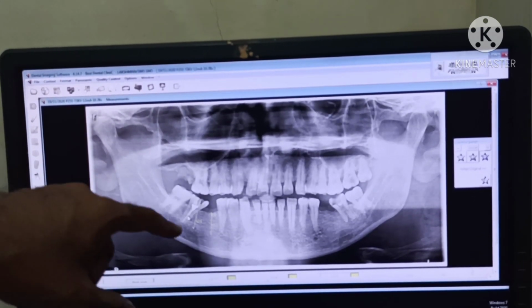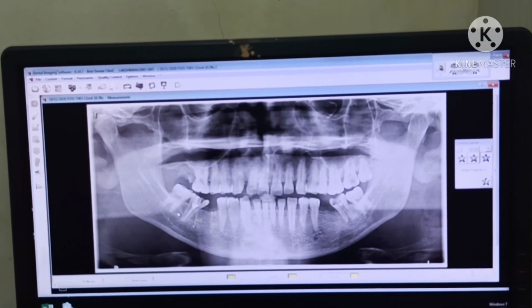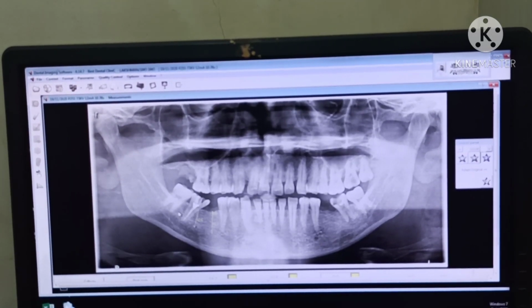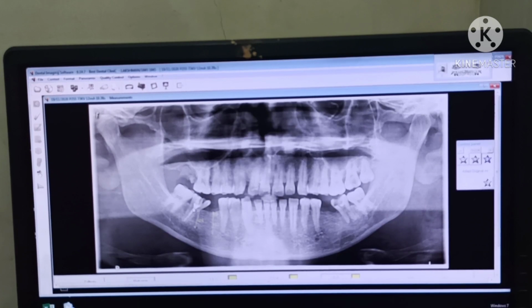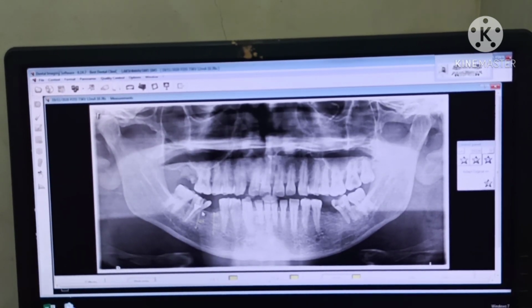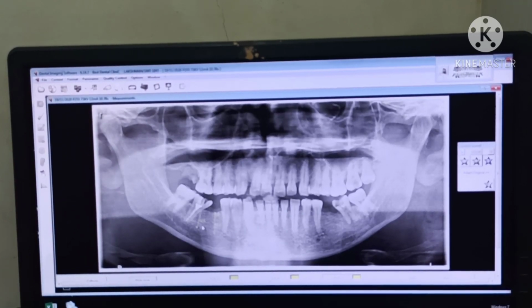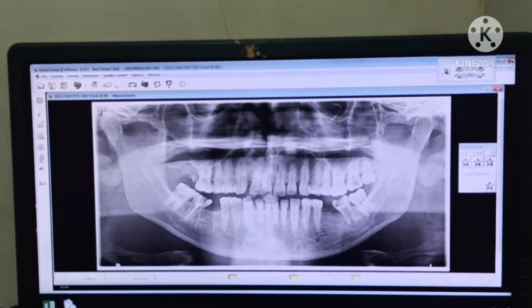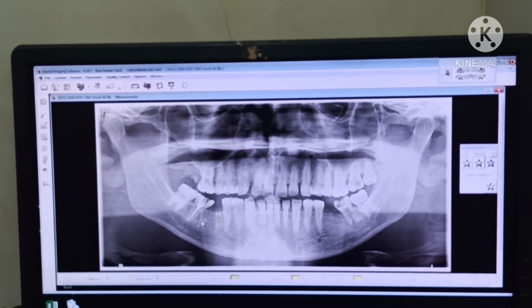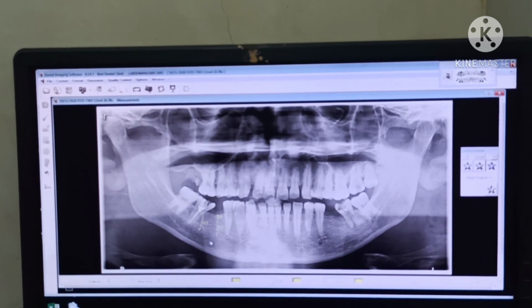Before starting this case, you have to keep a finger on the lingual side and look for the lingual mylohyoid ridge. If it is present, you can use it, but a much easier option is to place near this crest edge at this angle, and this much you can consider as a cantilever. So the length is around here, around 10 mm you can place safely.